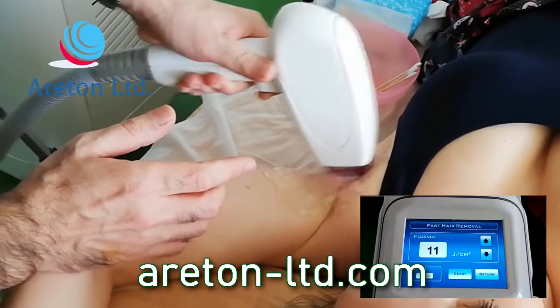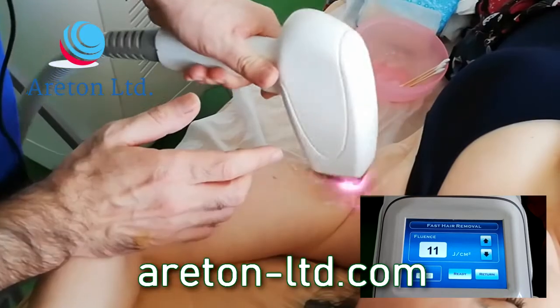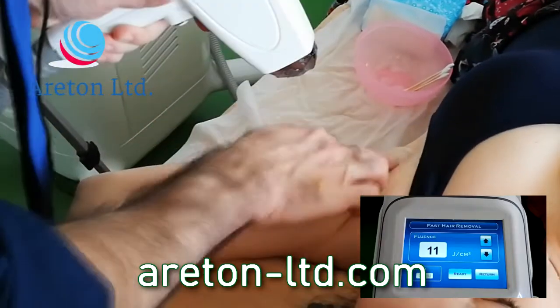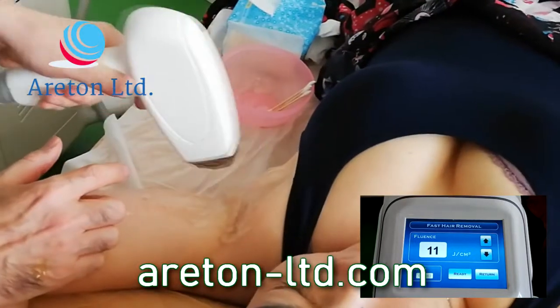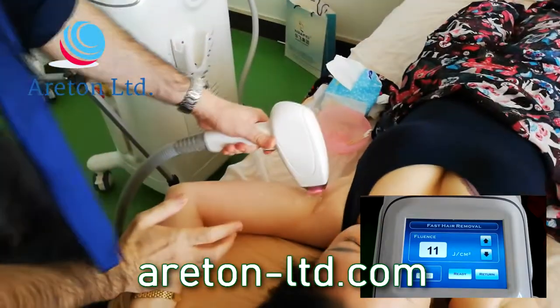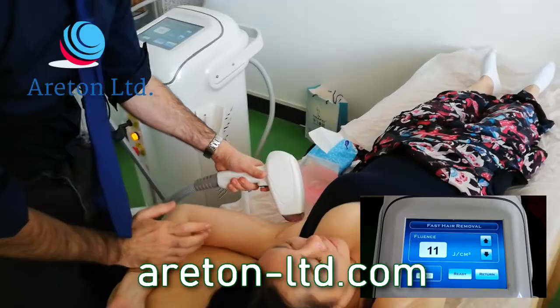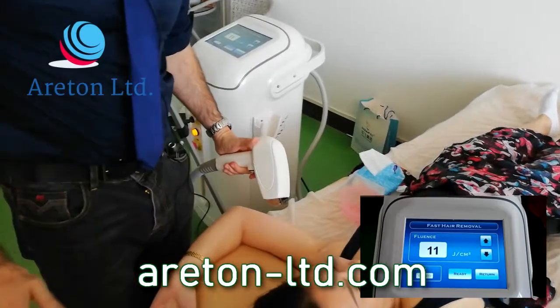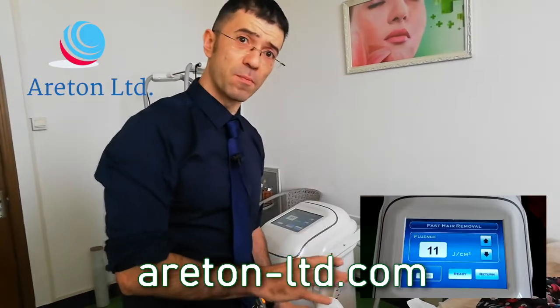So obviously just follow what the customer is feeling. If it's too hot, just stop for a while. Just move quite quickly all over the area. So she's feeling it's a bit too hot. So I'm almost finished. Very simple. Okay, so that's almost there. We're almost there. That's it. So we're actually done. So this is how quick the treatment is. And so this is the way you perform this treatment.